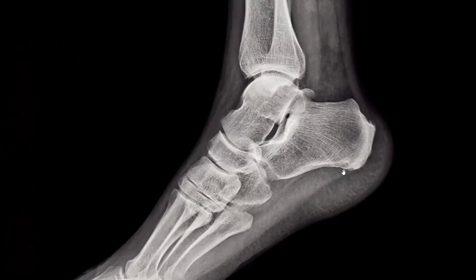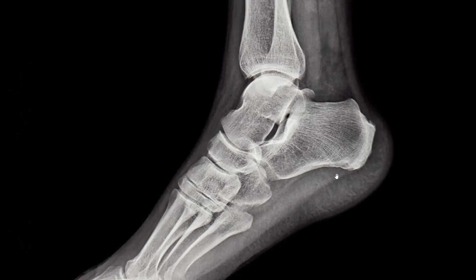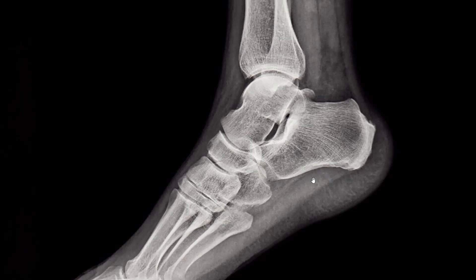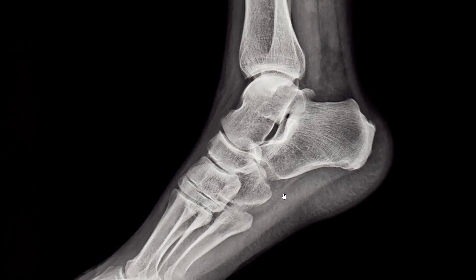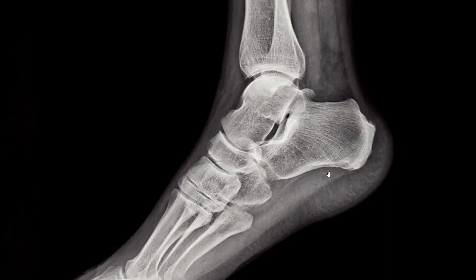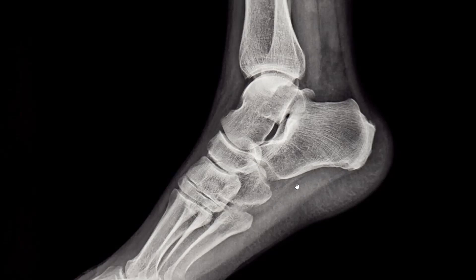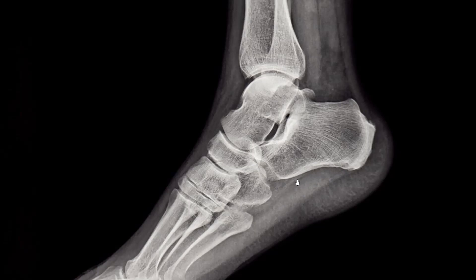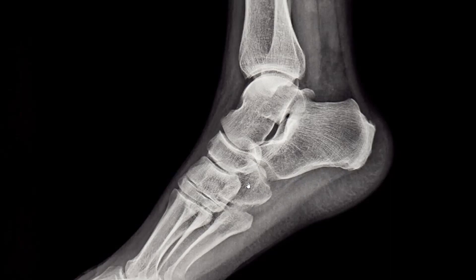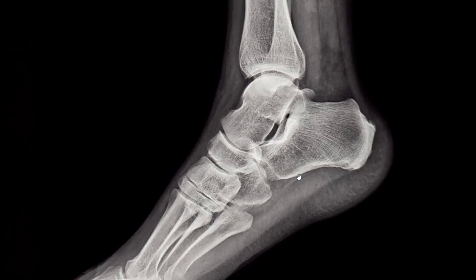There's a fat plane right above that. Here you see the flexor digitorum brevis muscle just above it. Above that, you see another fat plane, and this is the quadratus plantae muscle. These are flexor musculature.